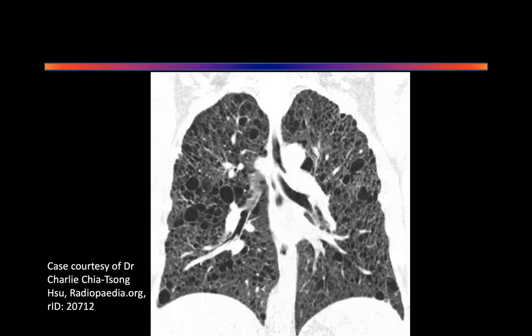So this is a multiple distributed pancystic appearance of the lung. Talk a little bit about the vascularity if you want. Anything specific about the vascularity? Anything more or less? Any comments? Or you can say that you can't comment. It's okay.